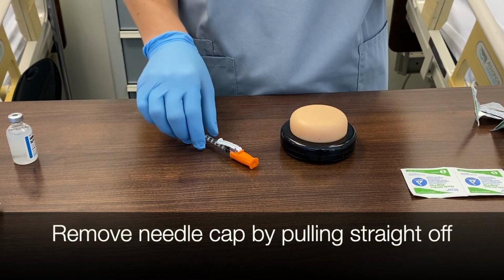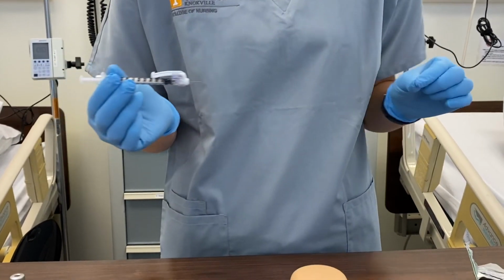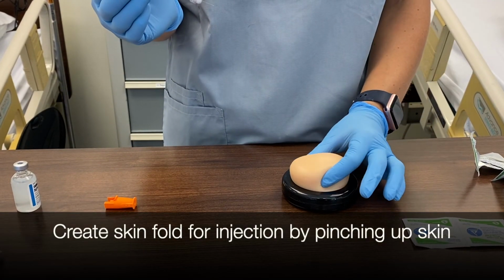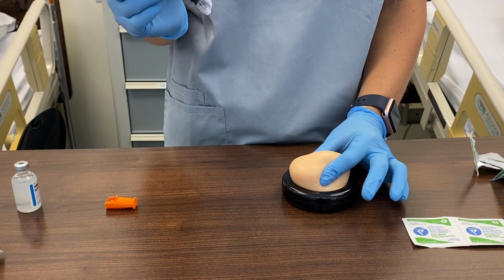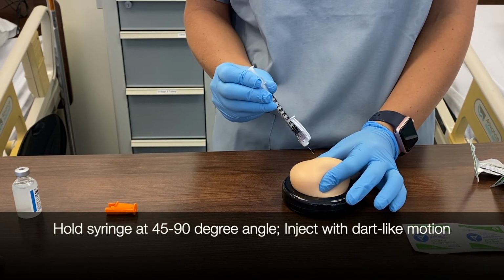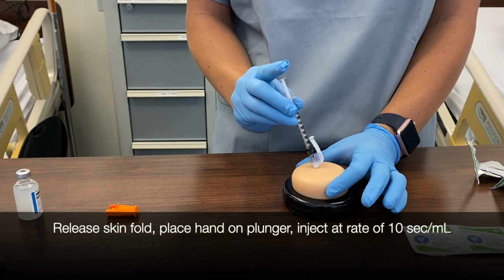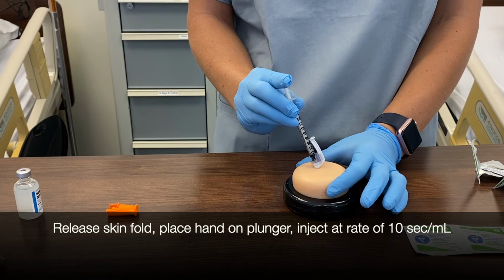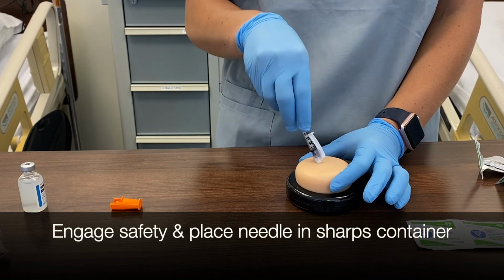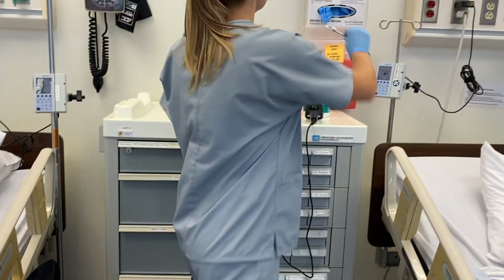Remove the needle cap on needle and syringe by pulling caps straight off. Create skin fold for injection by pinching up skin with non-dominant hand. Hold syringe in dominant hand at a 45 to 90 degree angle and inject needle in a dart-like motion. Once needle is inserted, release skin fold, placing a hand on plunger, and inject medication slowly at a rate of 10 seconds per milliliter, maintaining steady needle. Engage the safety immediately following injection and place needle in biohazard sharps container.